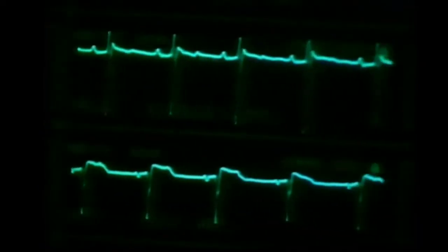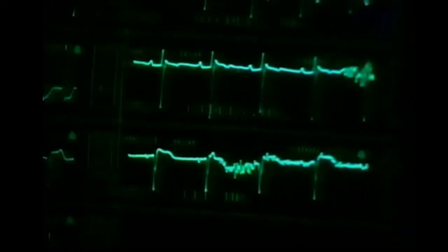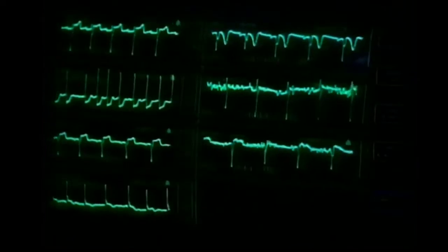The central station, or bedside EKG monitor and rhythm strip, are valuable tools that can be used to identify dysrhythmias, but they do not take the place of patient assessment. Some dysrhythmias may have little effect on one patient's hemodynamic stability, but may precipitate significant changes in another patient. Let's begin with a review of the electrical conduction system.